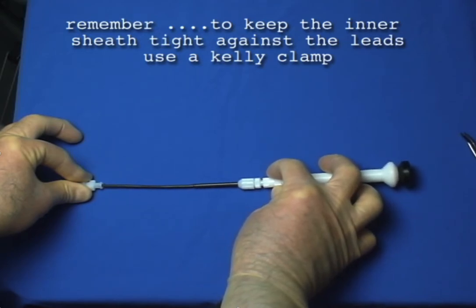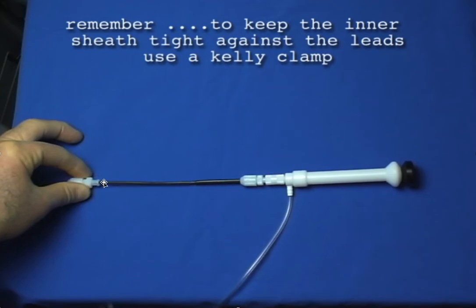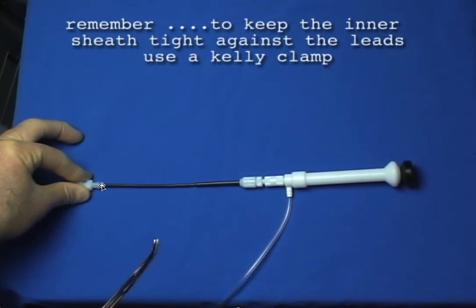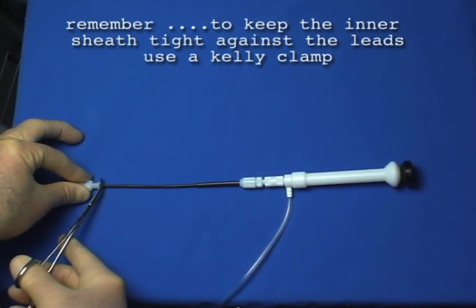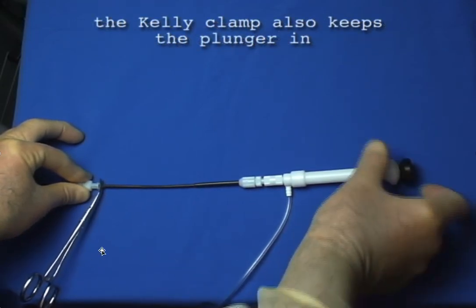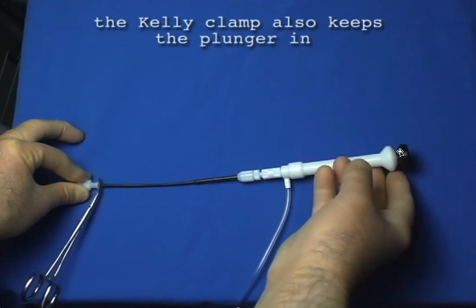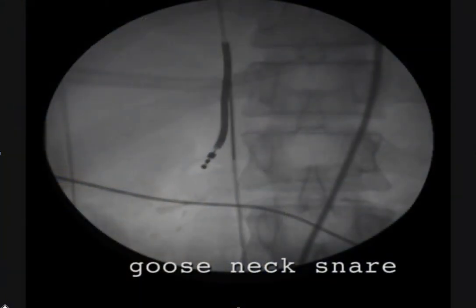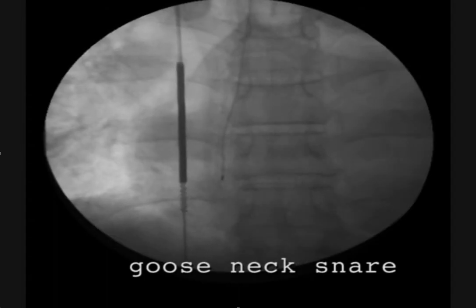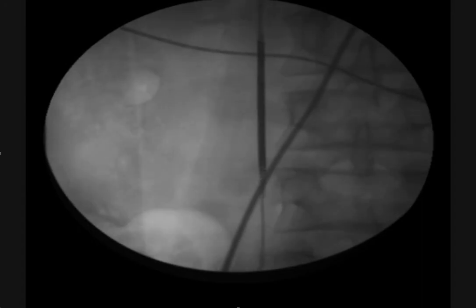So to prevent that problem, once you got it locked in place, get yourself a heavy duty Kelly clamp, pull tight, get it all locked up tight like that. And then when you are pulling it, you won't inadvertently slide this back and release the lead. And it also keeps the plunger in place. So I ended up having to grab that with a gooseneck snare and pull it out.